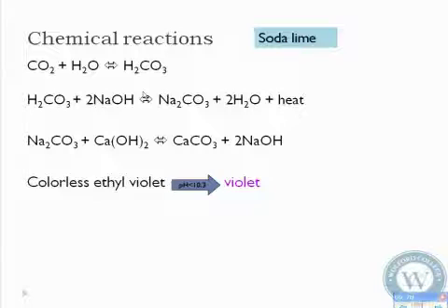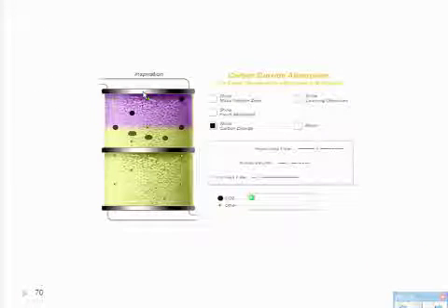All right. And remember again, a pH less than 10.3, that's the number for every type of CO2 absorbent. Less than 10.3 is going to turn purple in the presence of CO2. It does not turn purple unless it's exposed to CO2. So if it is dry, it will be white, and then it just won't absorb CO2. Okay? So here's what it looks like. All right, and it is this color purple. It is that clear. All right, it's not a matter of is it purple or is it not. It either is or it isn't. Okay? So at this point, that top canister, it's about 2/3 of the way. That would need to be replaced at that point.